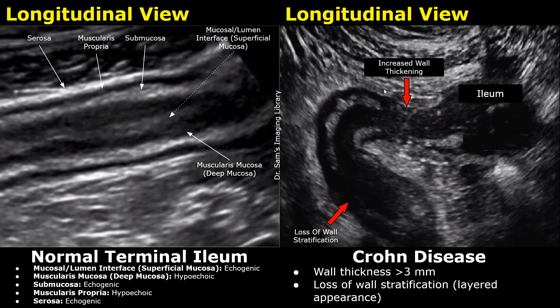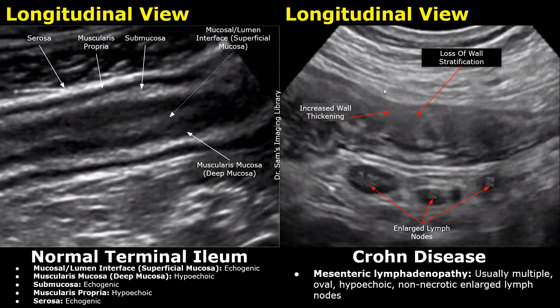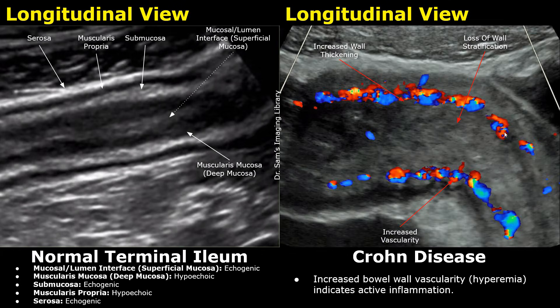In some cases of Crohn's disease, you may find enlarged mesenteric lymph nodes next to the bowel loop. Here we can see three enlarged hypoechoic lymph nodes. The bowel wall is thickened and there is loss of wall stratification. On color Doppler, the bowel wall will show increased vascularity — we will see multiple Doppler signals. Normally, we do not see any color Doppler signals in the bowel wall. This increased vascularity indicates active inflammation.